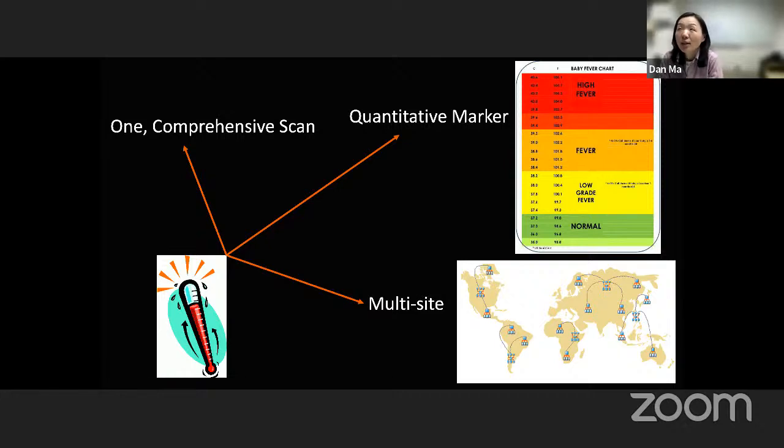So two ways. One is that MR fingerprinting has this inherent error tolerance because it's a matching. The example I always make goes back to human fingerprints. Lots of times human fingerprints are retrieved from the crime scene when there's just a partial fingerprint, but using the matching technology, you can still find the right person. It's similar for the MR fingerprinting scan as well. Because you have a big dictionary and the matching process, you have a very high error tolerance for the quality of the signals you acquire. So this is the one thing.